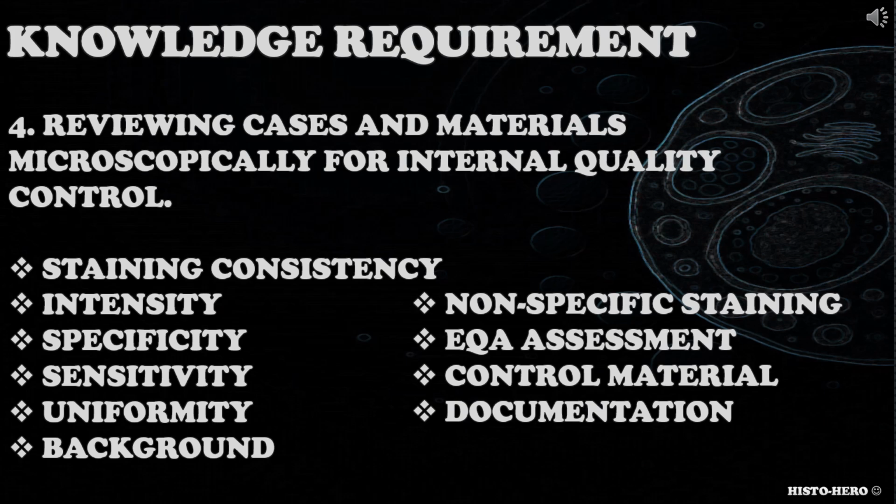When addressing this knowledge requirement, candidates should consider staining consistency and intensity, specificity of staining, uniformity of staining, presence of background staining, contamination or deposits, presence of nonspecific staining, EQA assessment criteria, control material used, documentation.